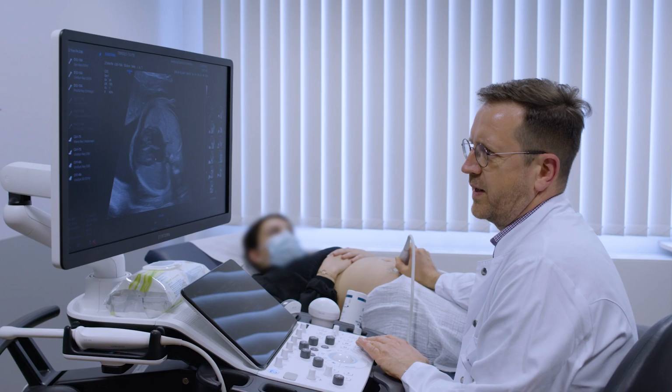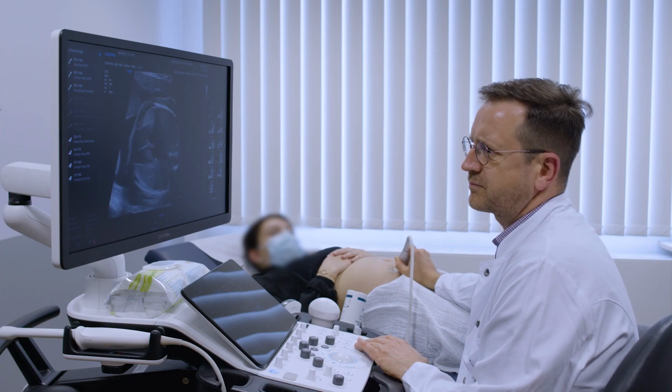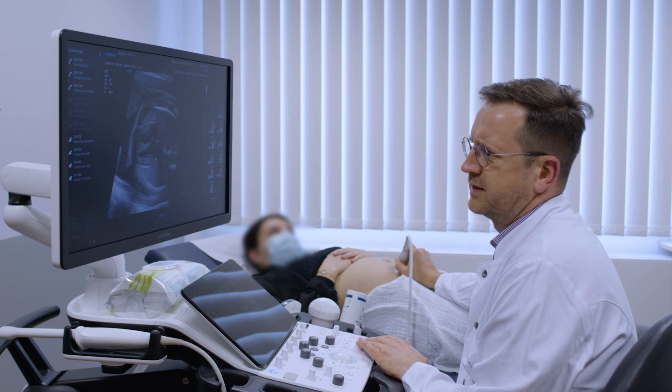This is very important to know when you're facing any abnormal anatomy in the fetus.